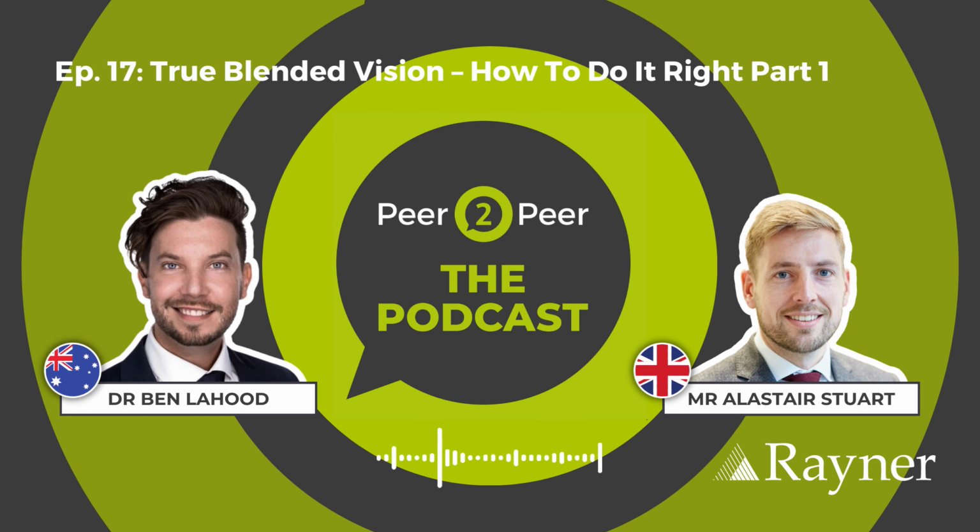I say, yeah, now look at your reading. And I hold the reading chart and I show them and say, look, that's why we're doing this. Because once I've put both eyes for distance and it looks great, you can't read anything. That conceptualizes it for them and really helps them. They say, okay, I get what's happening now. And they sort of bed into saying, right, I'll just get my head down and neuro-adapt over the next few months.